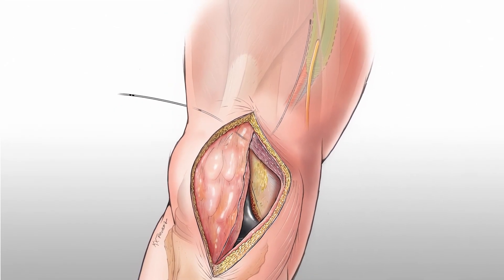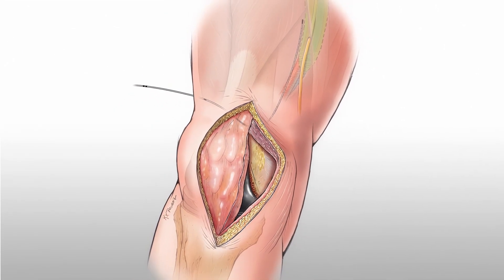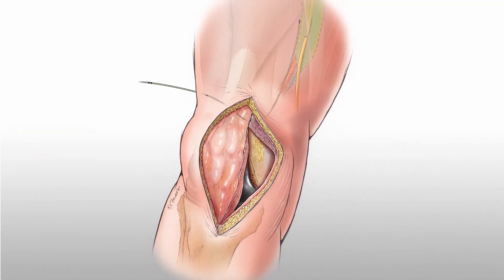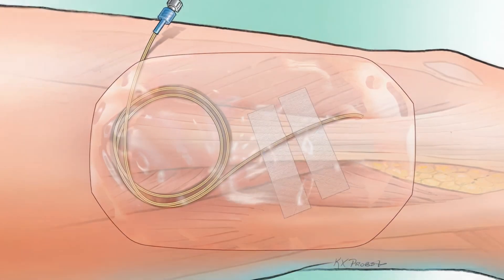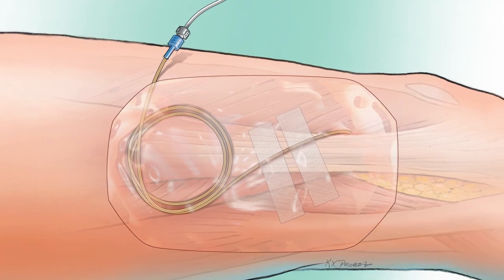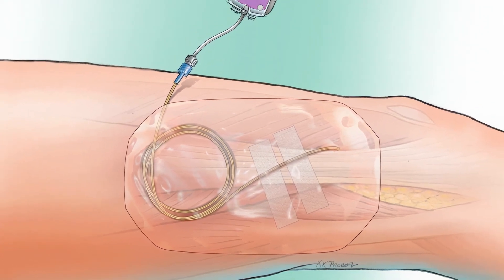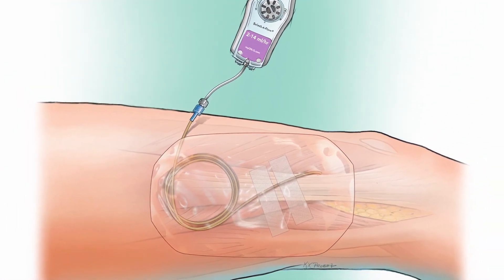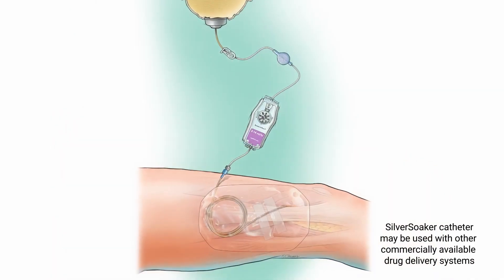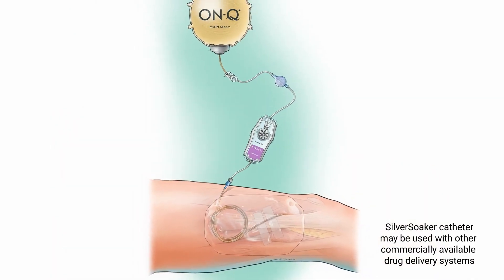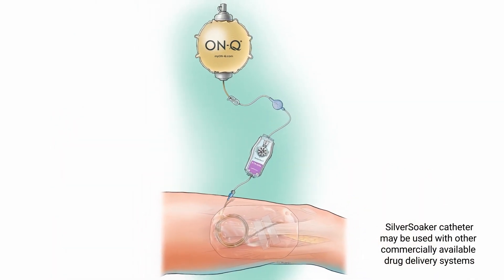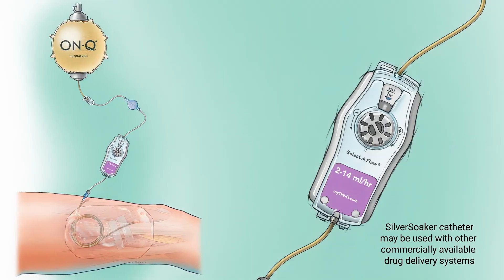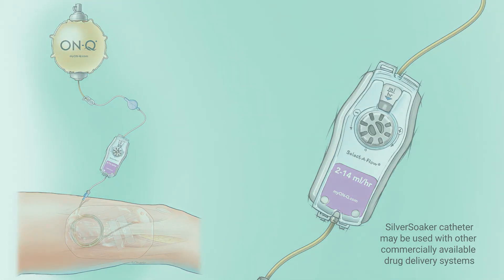Once the catheter is placed, the retractors are removed. The wound is irrigated and closed in the standard fashion of choice. After wound closure, approximately 3 to 4 cm of the catheter is coiled and secured with stereostrips and a tegaderm. Once the catheter is secured, connect it to the ON-Q or AMBIT pump. The flow rate is initially set and may be adjusted to the physician's preference.